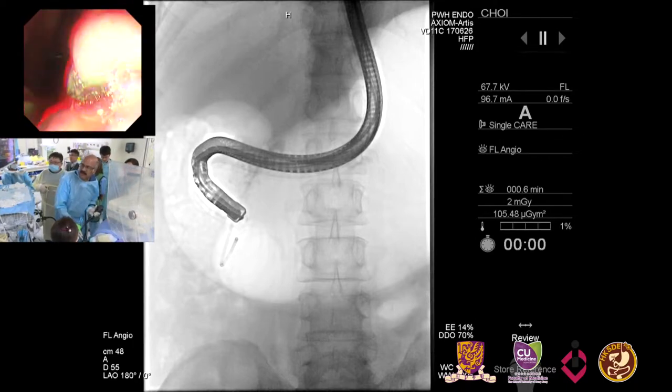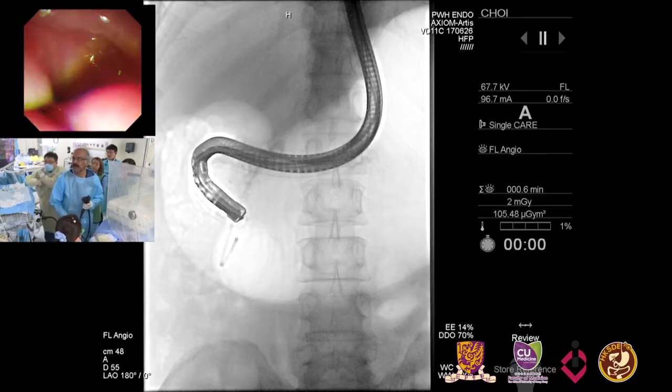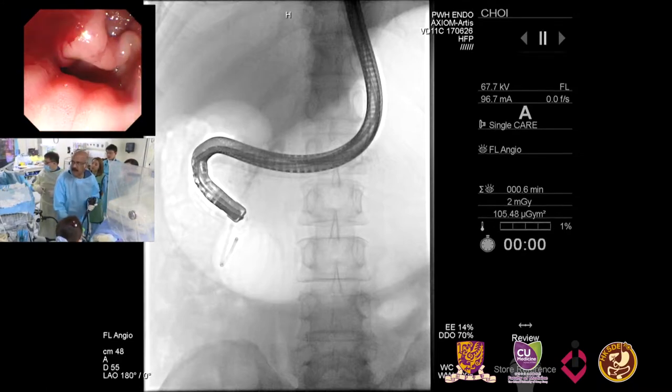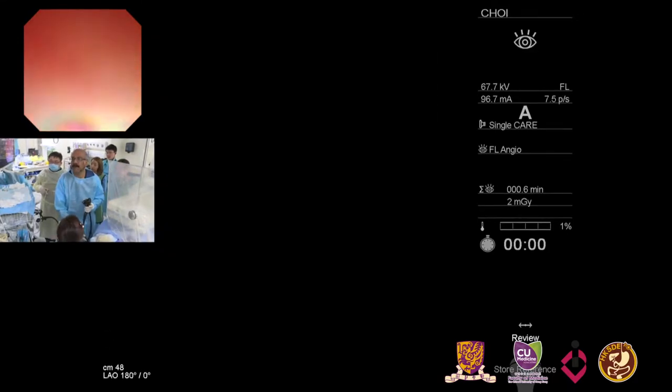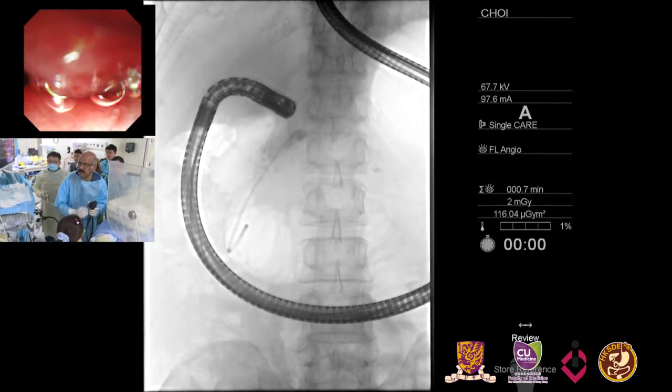Yeah, so you see, Uzma, what we found was that this was a very floppy stomach. We get to the duodenum, and when we get into the second part of the duodenum, we're not able to shorten the scope. It's becoming extremely difficult to shorten the scope because of the fibrosis around this area. So you would do it in the semi-long position then? Yeah, I think we have to, but the problem is passing a pancreaticoscope is not going to be easy.